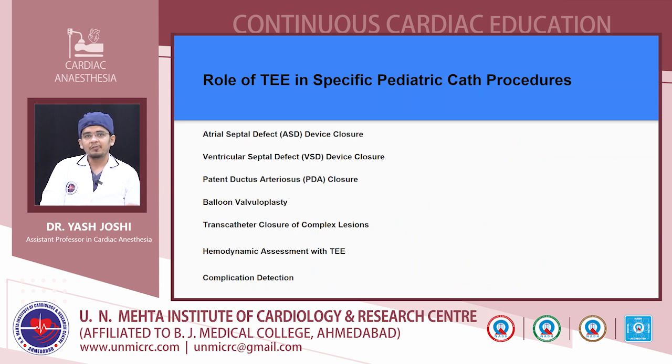Now coming to the specific pediatric cath procedures, it is helpful in ASD device closure, VSD device closure, PDA device closure, and balloon valvuloplasty like aortic and pulmonary valvuloplasty. It helps in transcatheter closure of complex lesions. It helps in hemodynamic assessment as well as early detection of complications.